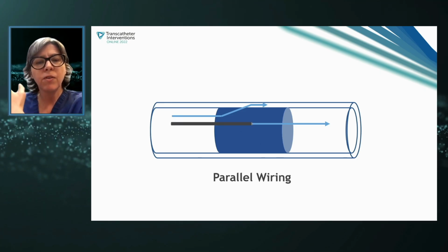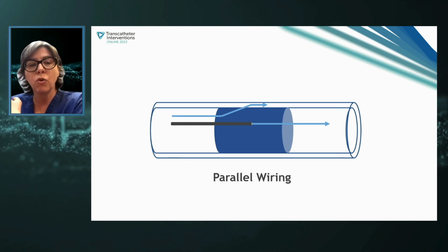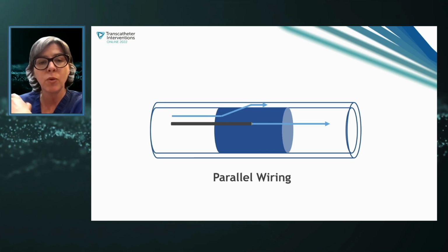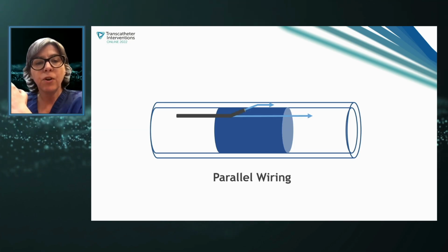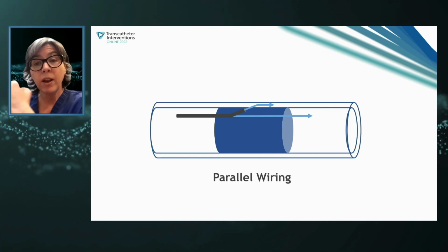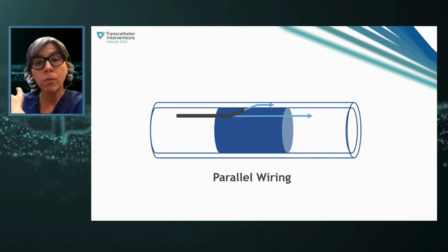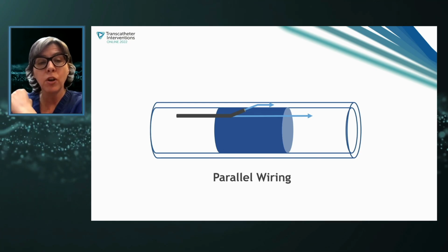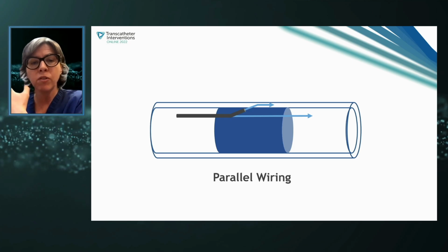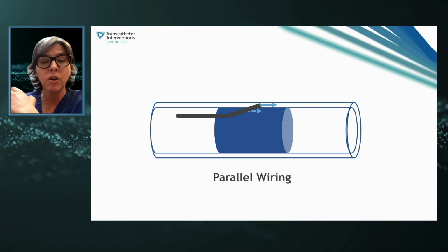The technique further evolved with the development of the single lumen microcatheters, which allowed better support and control of your wires and the ability to reshape the wire tip for better steerability in the direction in which you wanted to travel. The technique further evolved with the availability of dual lumen microcatheters. So if the first wire went extraplaque, you could track the dual lumen on that wire. That wire then stabilized the dual lumen microcatheter, again giving you even better support and control of your second wire to try and cross the occlusion. And then more recently, the technique has become even more sophisticated with the availability of the dual lumen triple exit port microcatheter or the recross catheter.